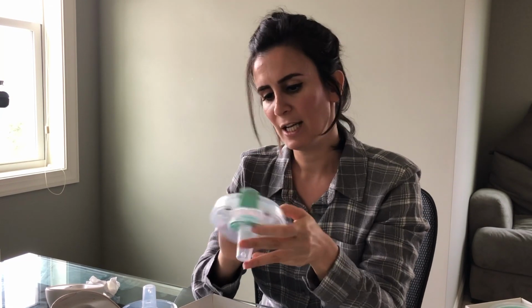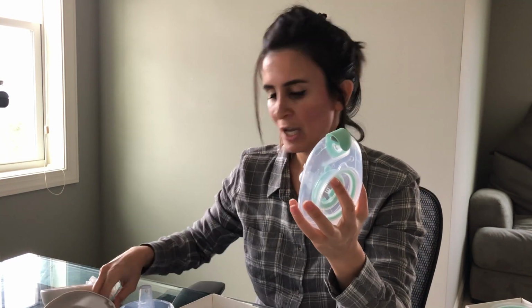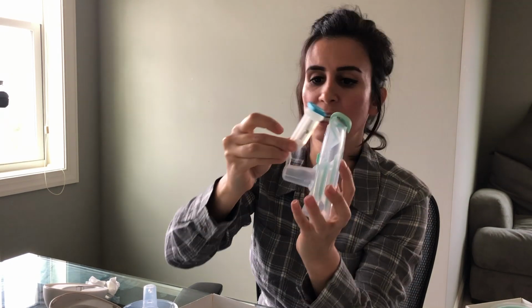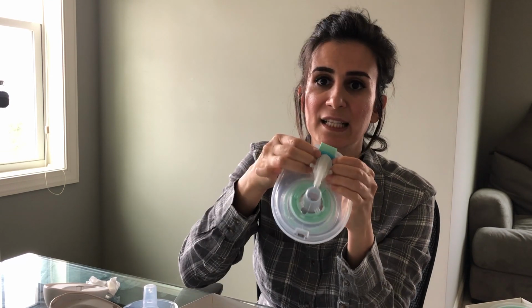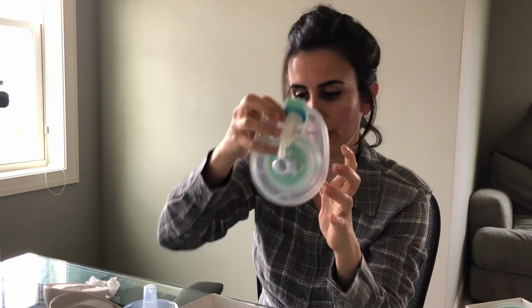It's simple. I know there's a lot going on with the container, so once we demystify it, everything will be simple. Then you have the flex tube, which you already have with a Willow 2.0, and you put it on just as you would expect. But the only difference here, guys, is this will not click into place like it does with the bags, okay? This, you just have to put it on, place it, and then just press firmly.